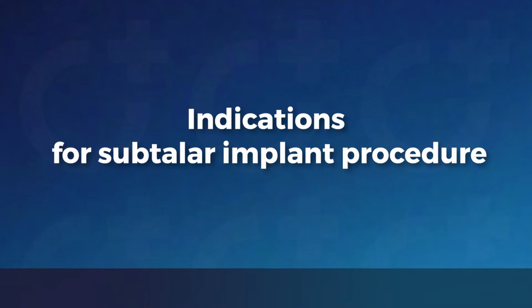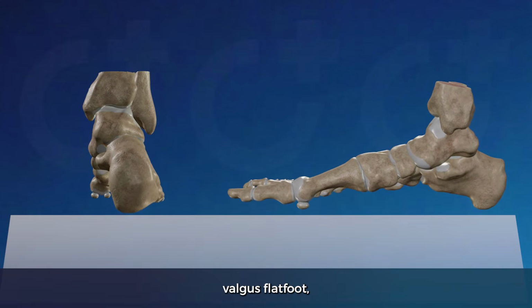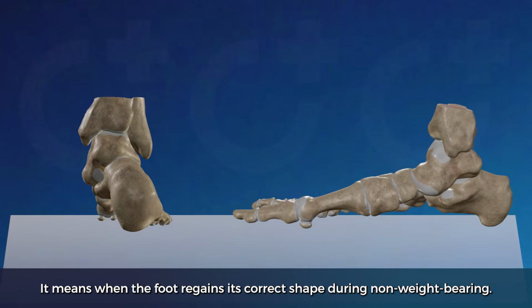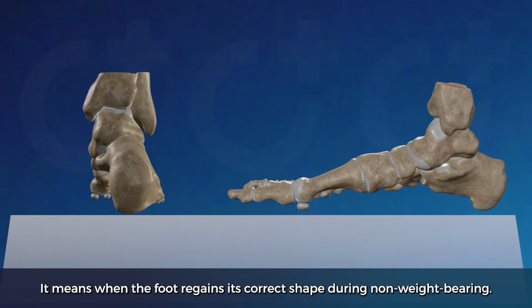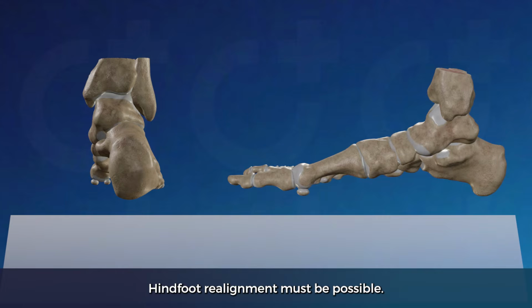What are the indications for subtalar implant procedure? The procedure is performed in the case of pain in the flexible valgus flatfoot, when the deformation has not yet become fixed. It means when the foot regains its correct shape during non-weight bearing. Hindfoot realignment must be possible.